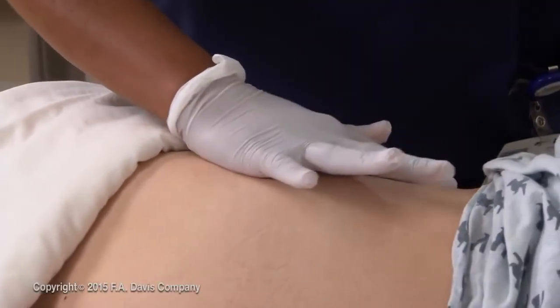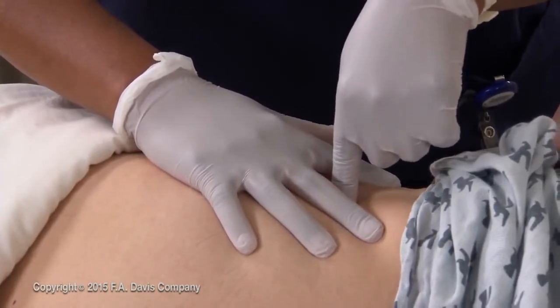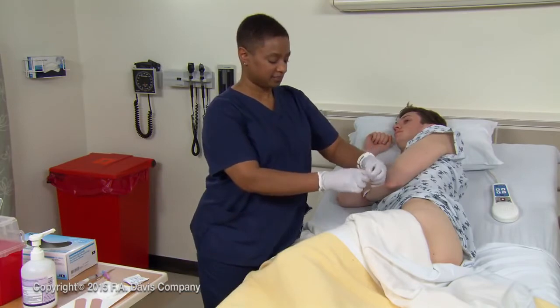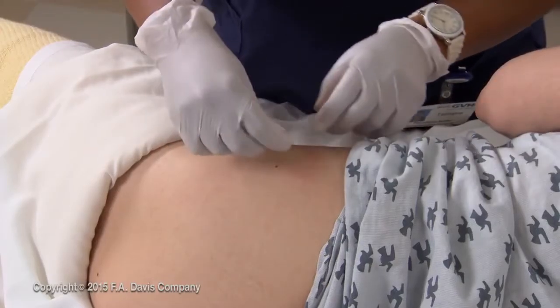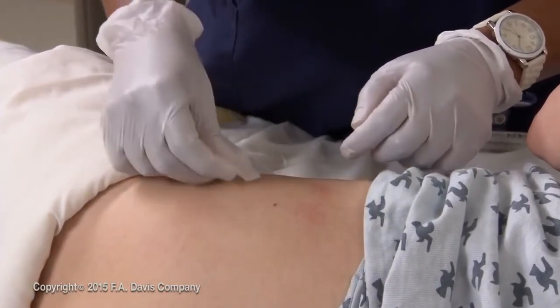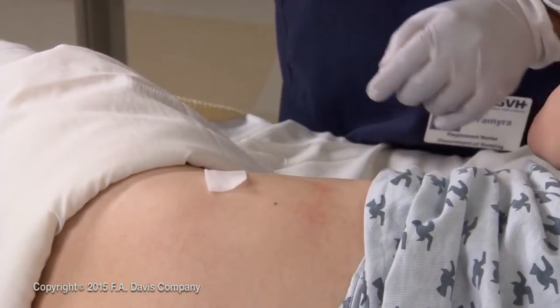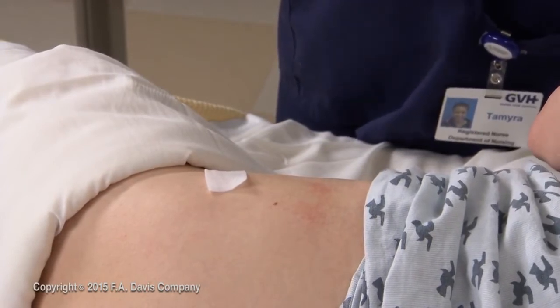Using appropriate landmarks, identify the injection site. Thoroughly scrub the injection site with a CHG-based antiseptic or an alcohol prep pad. Do not go back over previously scrubbed areas. Place the wipe on the patient's skin outside the injection site with a corner pointing to the site. Allow the site to dry before administering the injection.